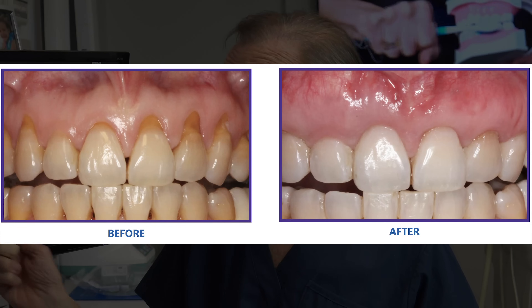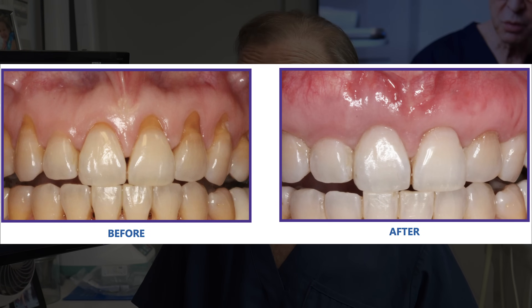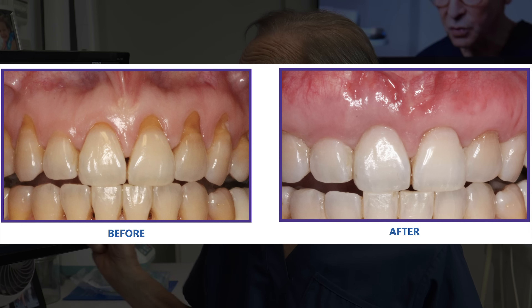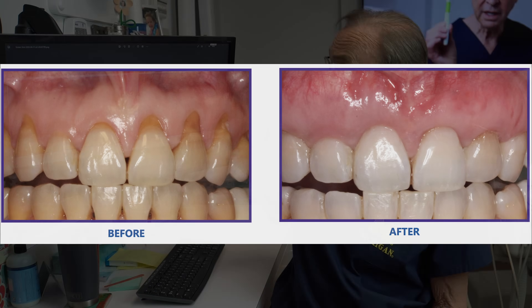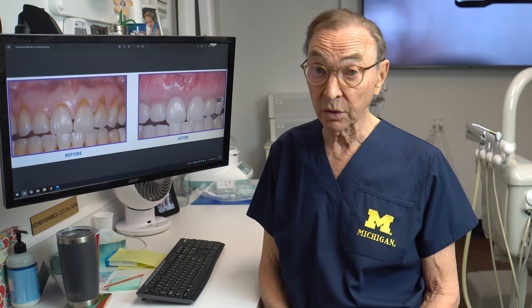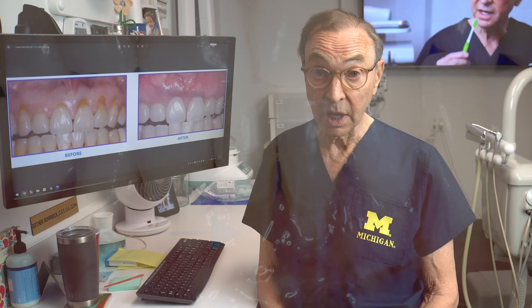Here's a patient who came in with a great deal of recession around their upper teeth. This was the case before, and after we did the pinhole technique and brought that gum tissue down, we got thicker, healthier gum tissue that I think is going to enable this patient to keep these teeth for the rest of their life.